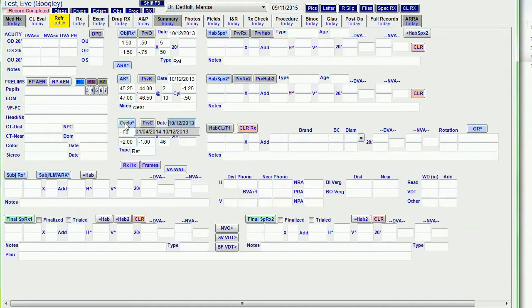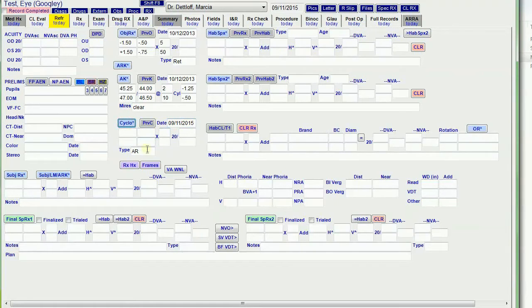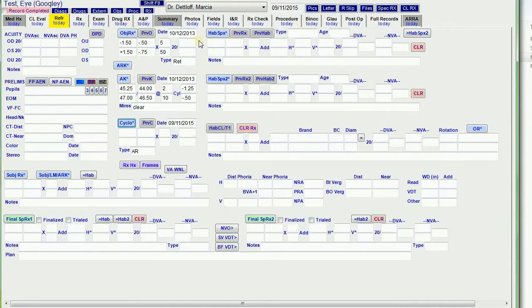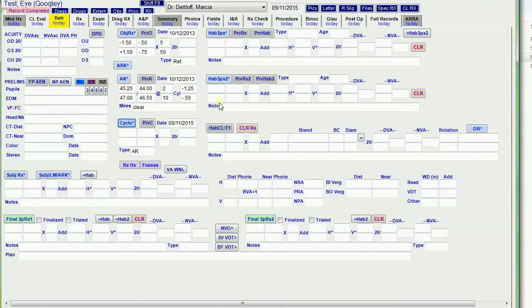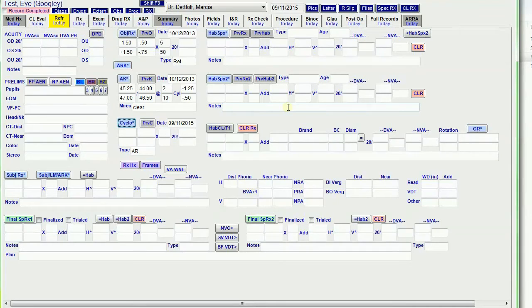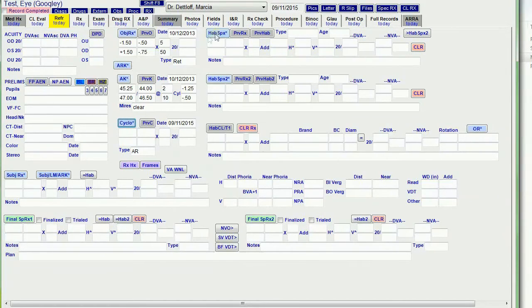If I do the regular cyclo, it puts in the current date unless it is AR. For habitual RX, I have places for two habitual prescriptions. If they have three or four or more pairs of glasses, I just put that information in the notes. I didn't want to waste a bunch of fields when most patients don't have more than two active pairs of glasses.